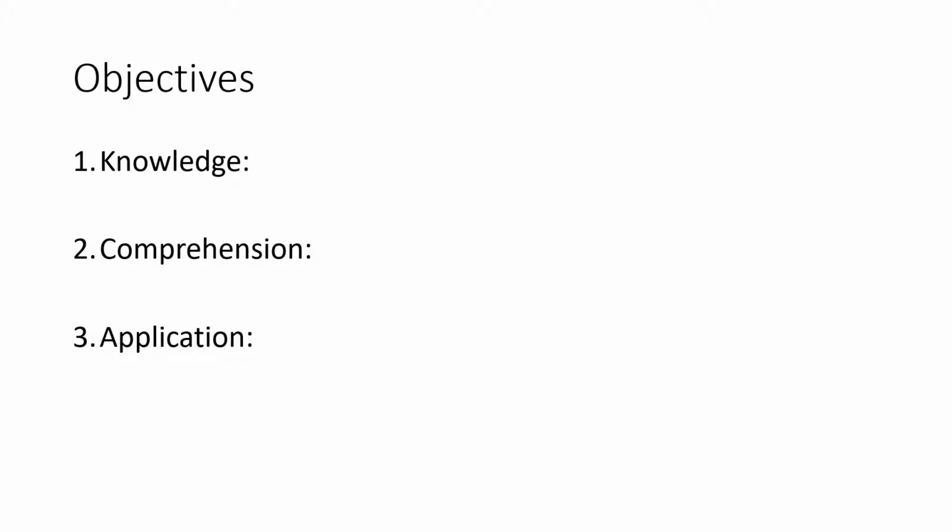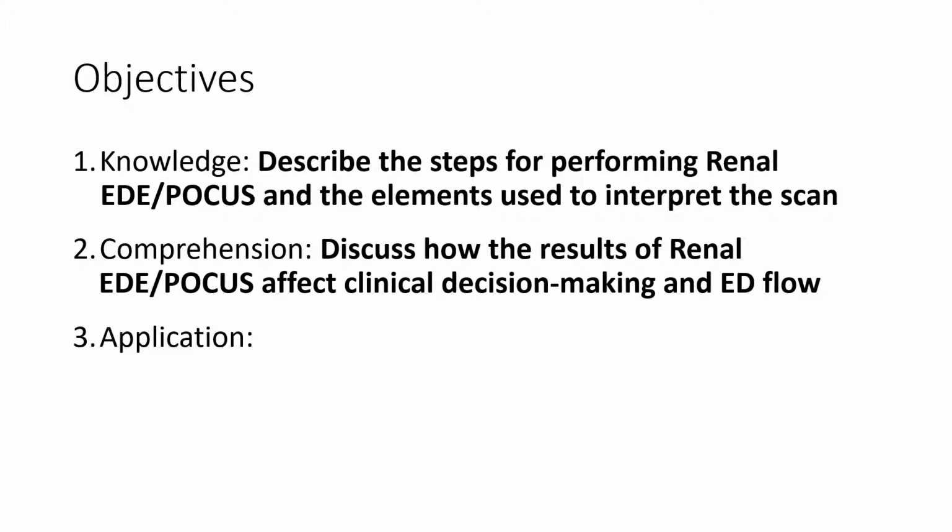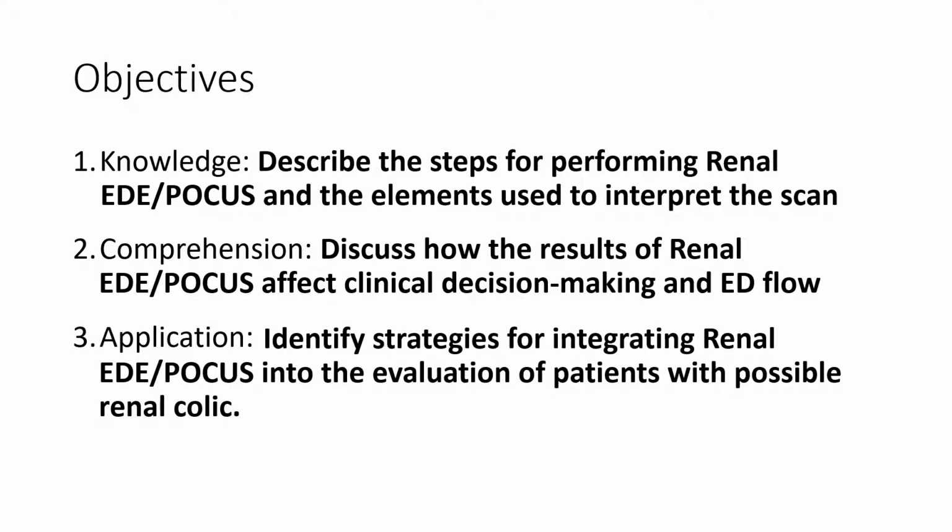Here are the objectives for my talk. Knowledge. Describe the steps for performing renal EDE and the elements used to interpret the scan. Comprehension. Discuss how the results of renal EDE affect clinical decision-making and ED flow. And application. Identify strategies for integrating renal EDE into the evaluation of patients with possible renal colic.